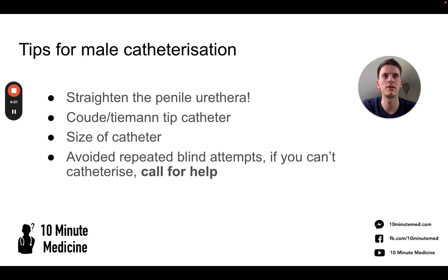Now this is probably the most important one, because catheters can cause serious damage that can cause problems for patients. So always call for help if you fail a couple of times. I think twice is probably a good guide to attempt catheterization, and then call for help if you can.